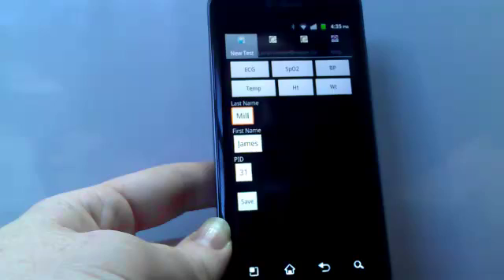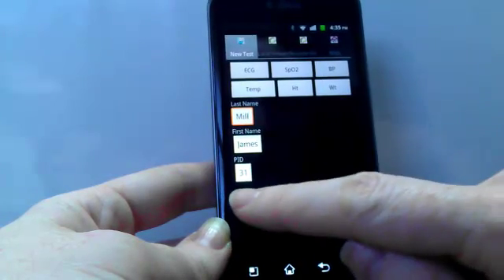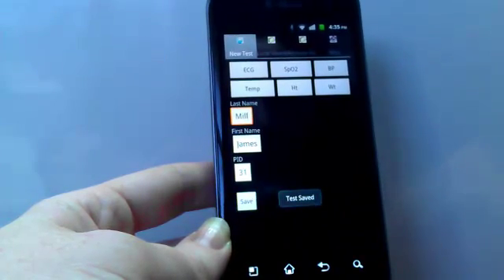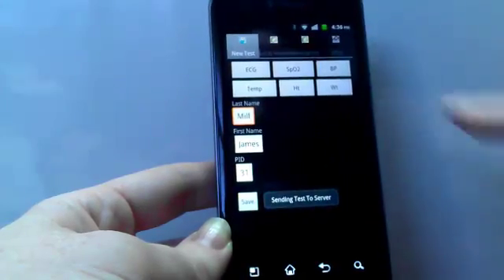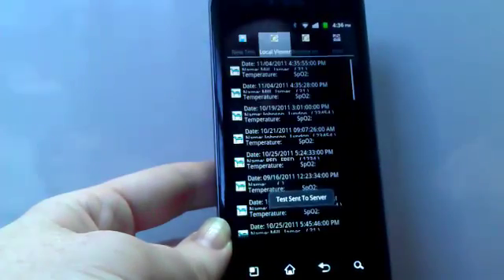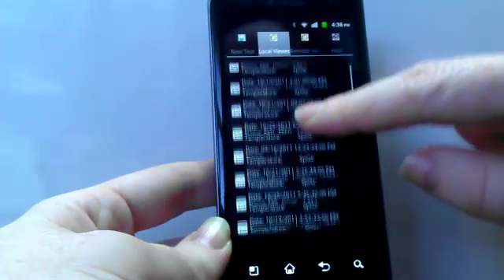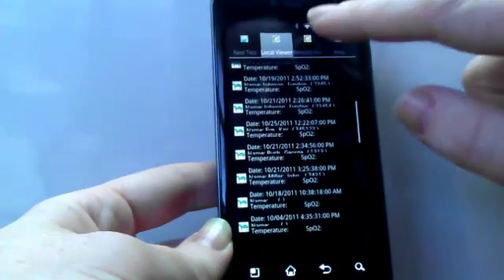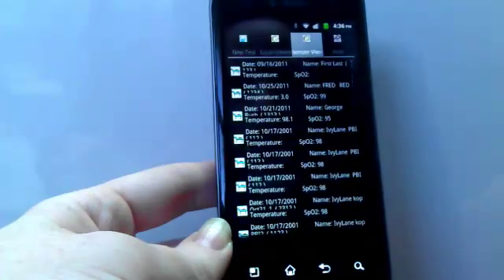Once all tests are complete for a patient, hit the Save button and the information will save all the data to the patient chart and also to our online Cardio Remote account. To review all patient data you've collected, tap the remote button. This will access your full patient database for your user account.